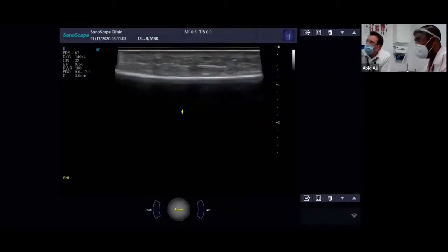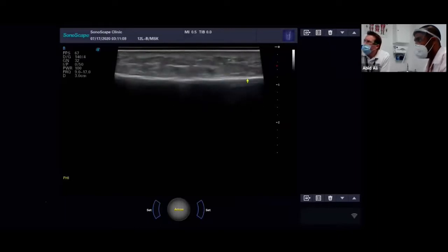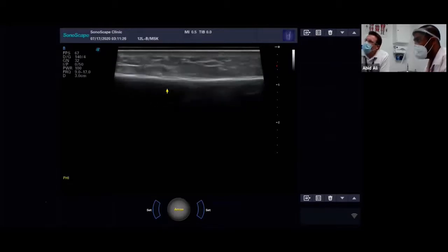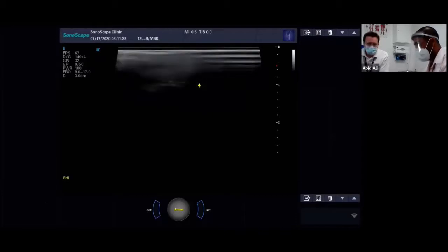So the tibia bone is the bright white line, which Adrian is marking out there with his yellow cursor. So you can see anything after the white line, it pretty much goes dark. We have lost signal here. The ultrasound probe signal is unable to penetrate past the bone. So we can see the tissue very well. We can see the cortex of the bone very well. You could even pick up stress fractures here very nicely, but of course you can't see any further detail of the bone, certainly not through the bone.